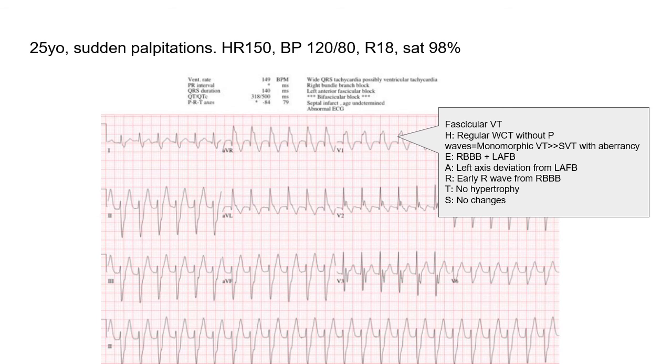But if you look at the wide complex, we see there's no P wave. So the thought is that maybe this is more monomorphic Vtac.